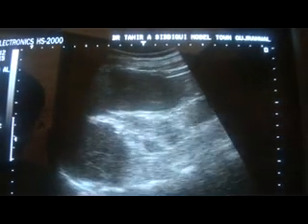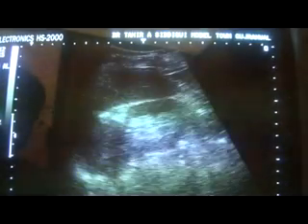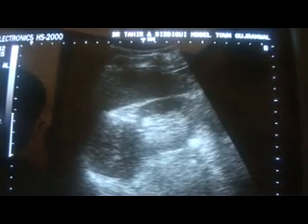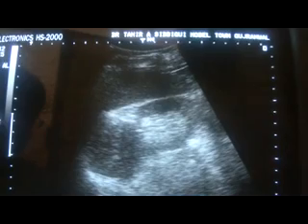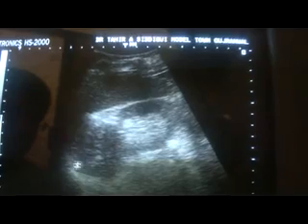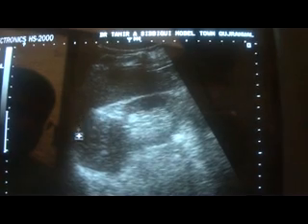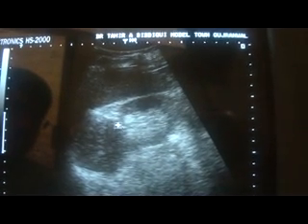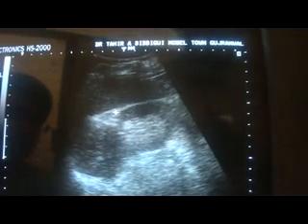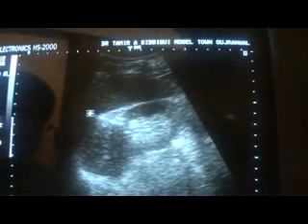Now you see that this echogenic area has an echogenicity that is slightly less as compared to the renal parenchymal echogenicity, or almost equal, you can say, to that of the renal parenchymal echogenicity. So the mass does not have increased echogenicity, rather it has echogenicity almost equal to that of the adjacent normal renal parenchyma.